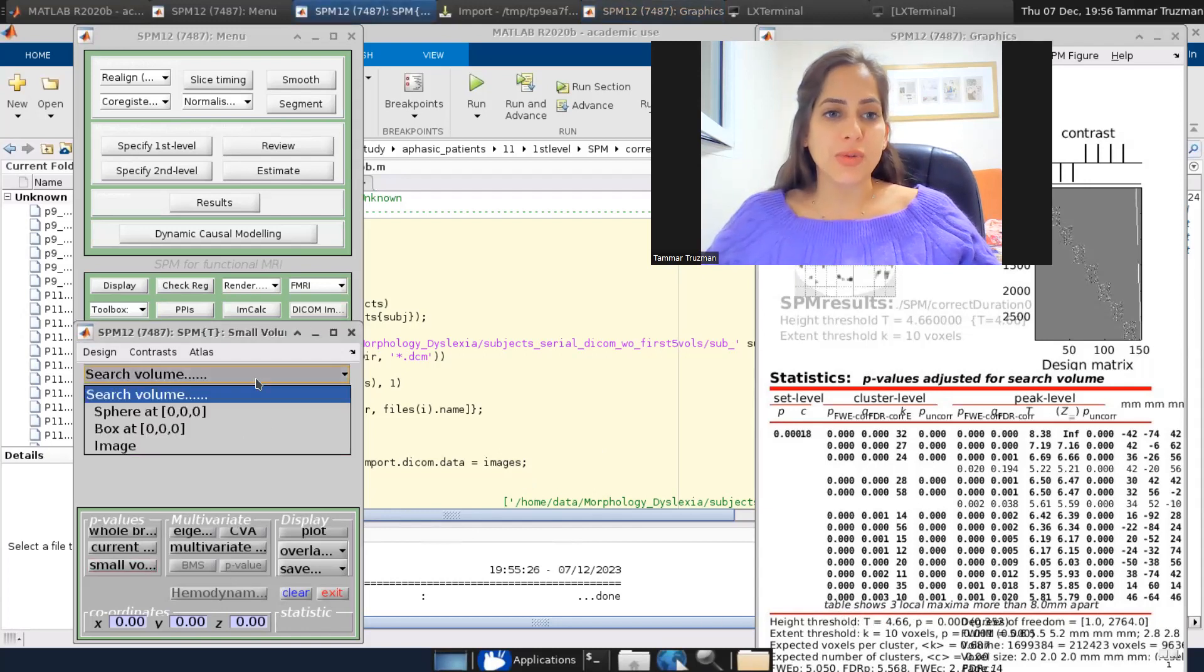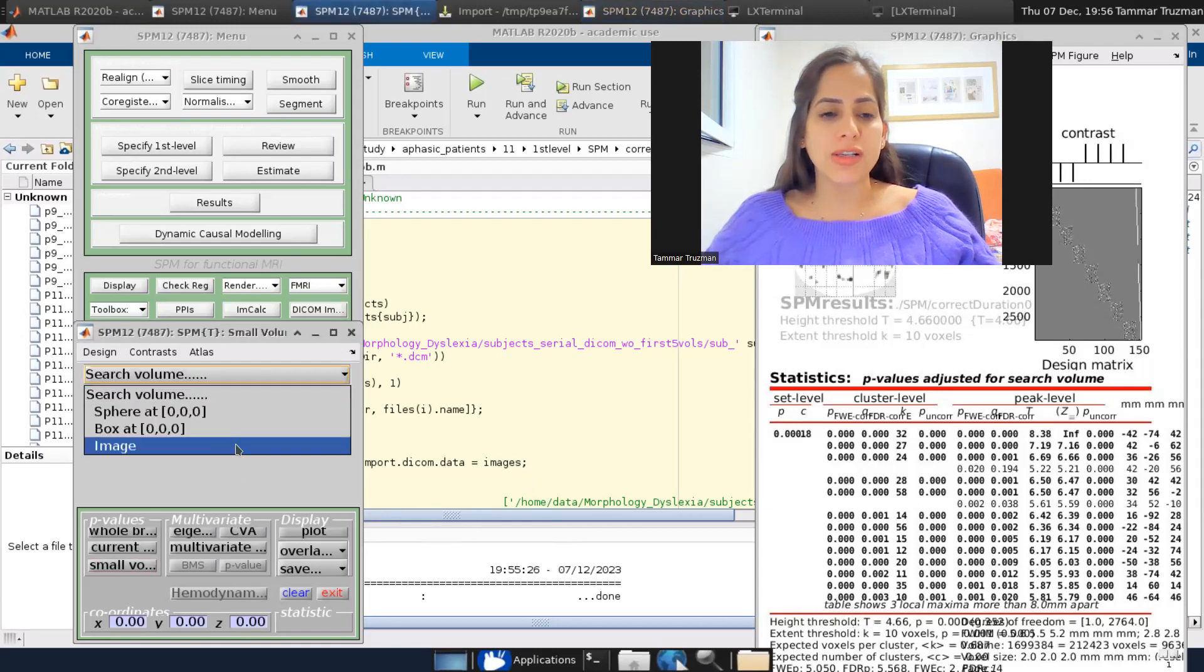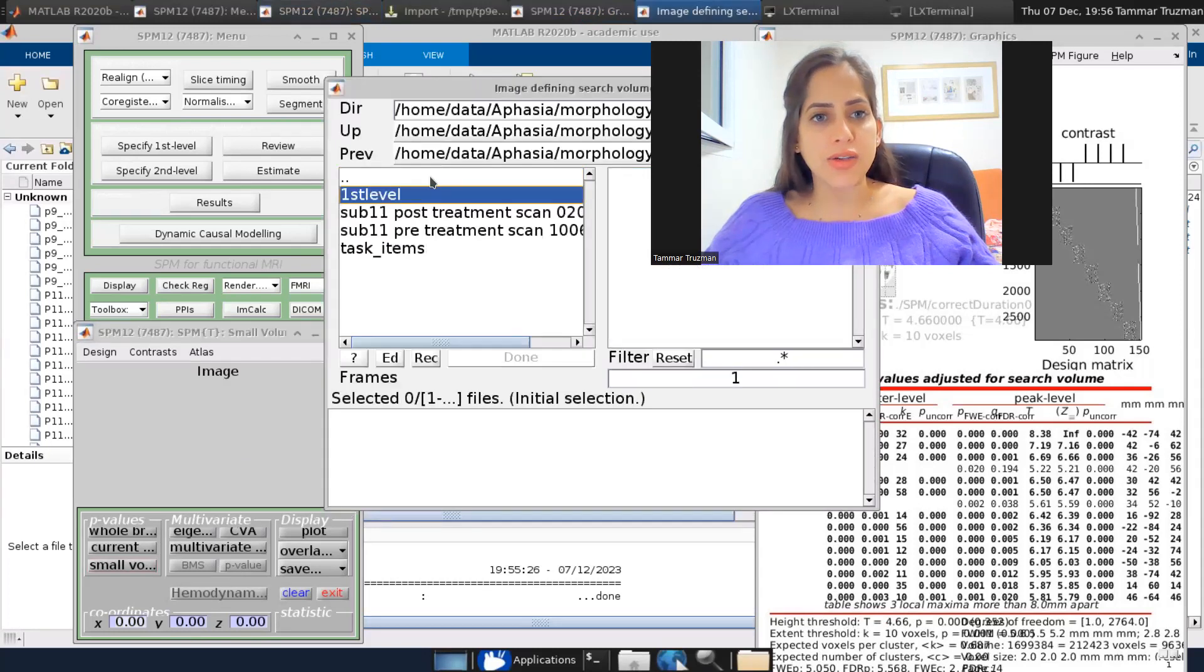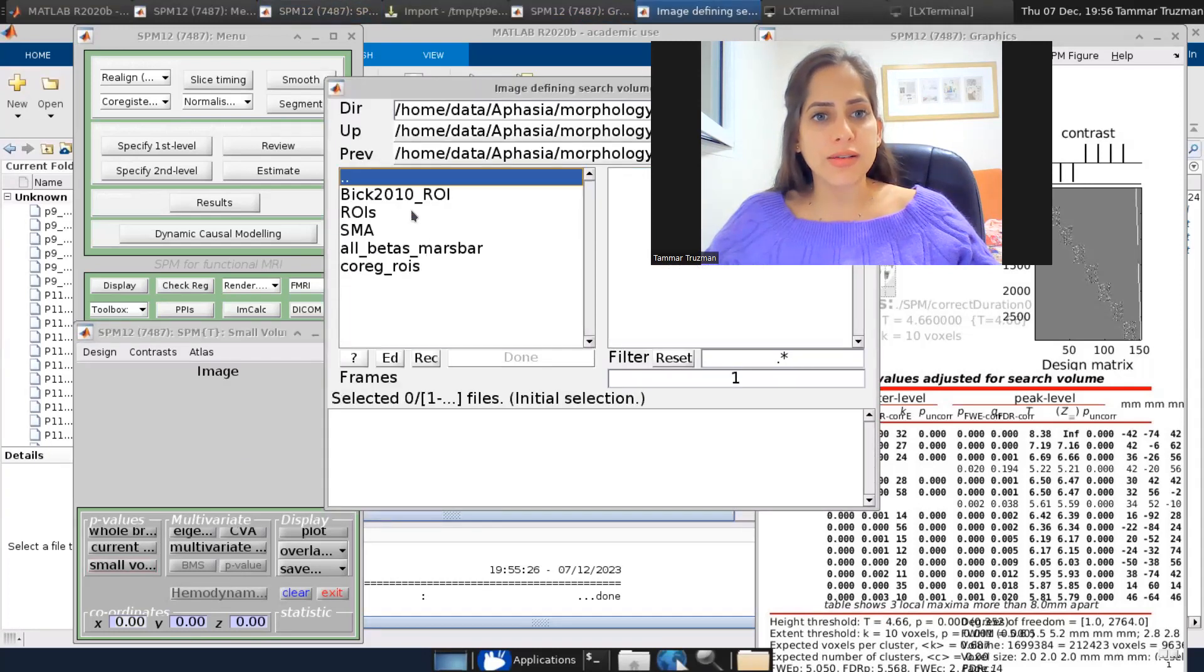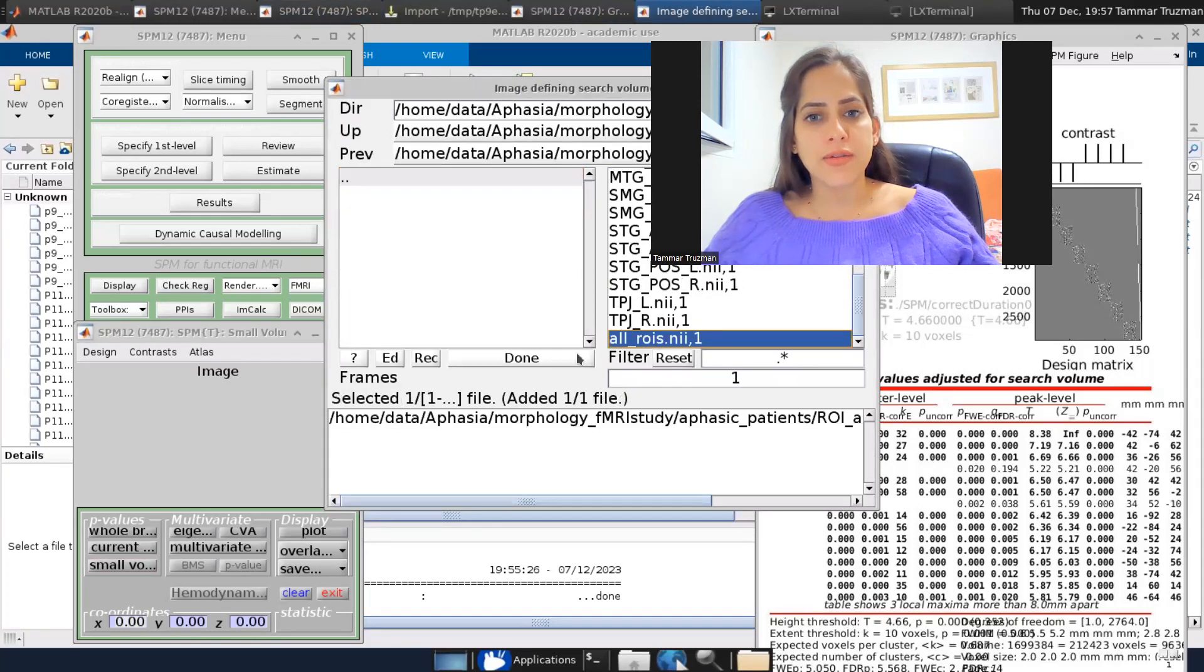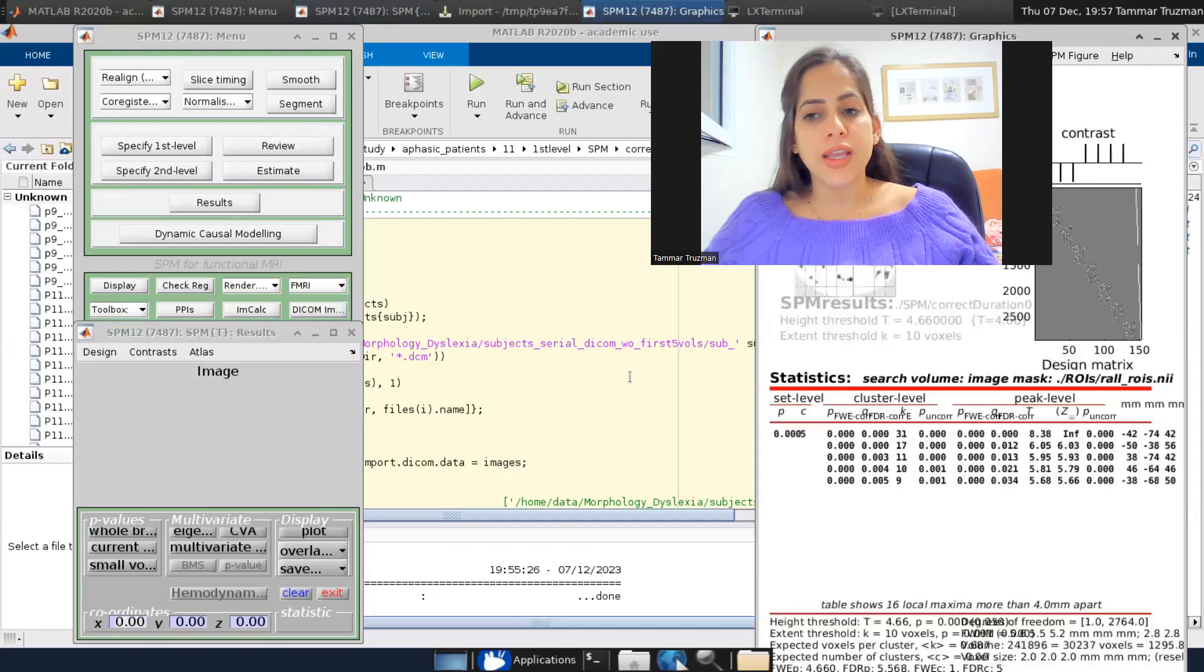Now I'm telling the SPM, please apply that correction at this high threshold only for my VOI. So again, I'm going to small volume correction and choose my VOI, choose my mask.